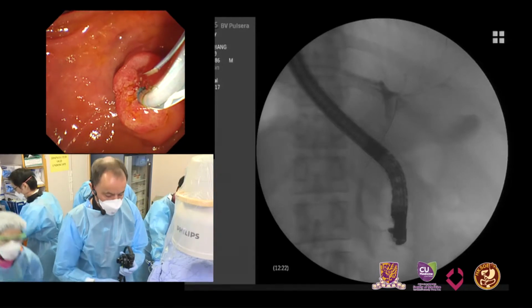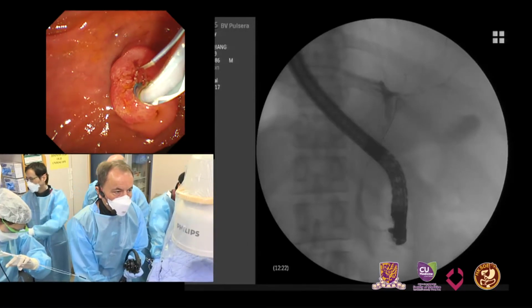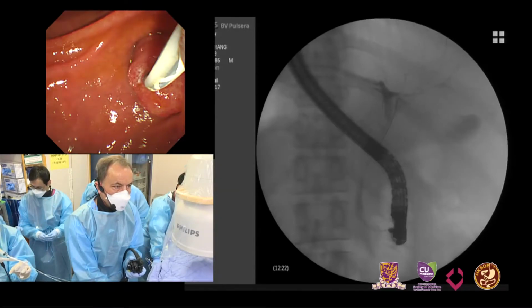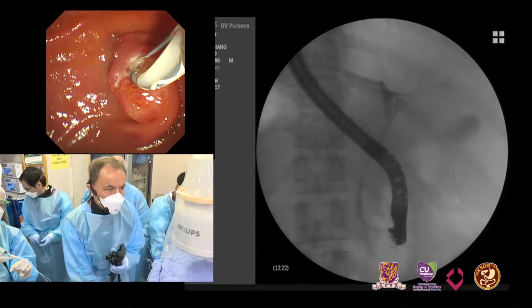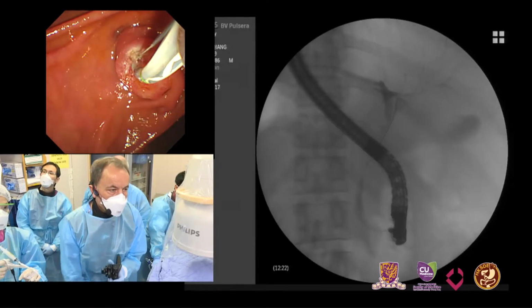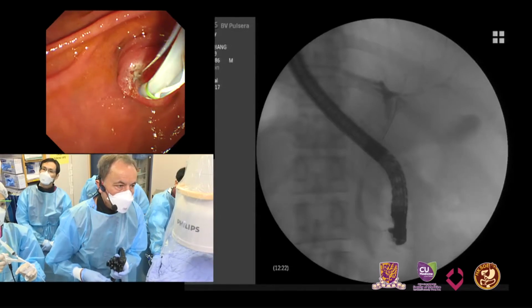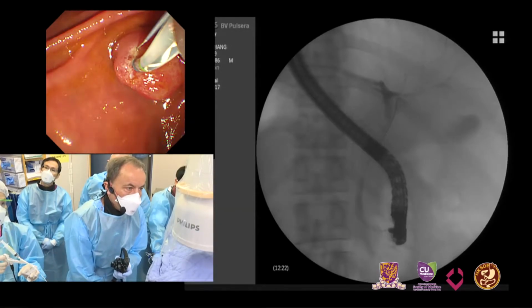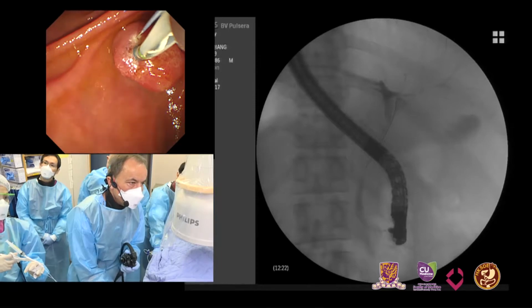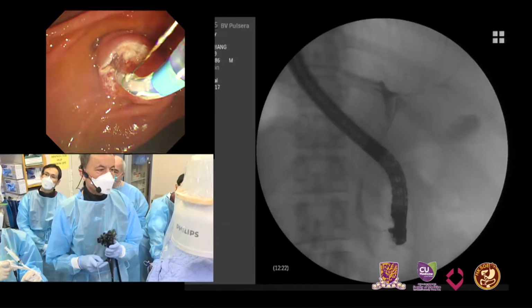So we are in a good direction. I don't touch the catheter, but I direct the cutting wire with the endoscope and split the papillary orifice, the biliary orifice. And so at the proximal part, I leave only a small part of the cutting wire inside. As you can see, only a few millimeters. I rotate the endoscope to the left to have some pressure on the papillary roof. Okay, that's fine. Horst, I have a question.